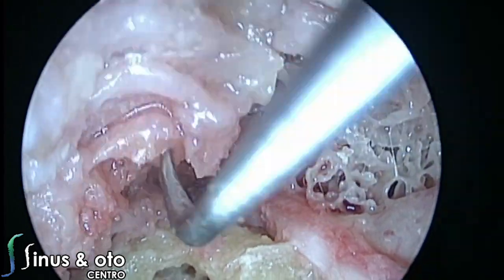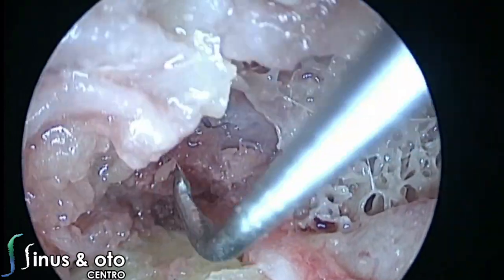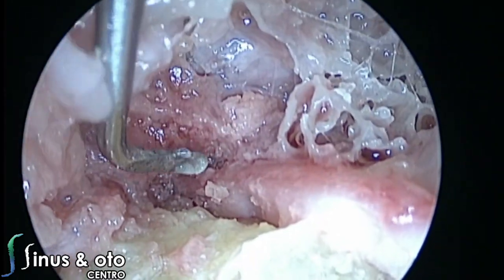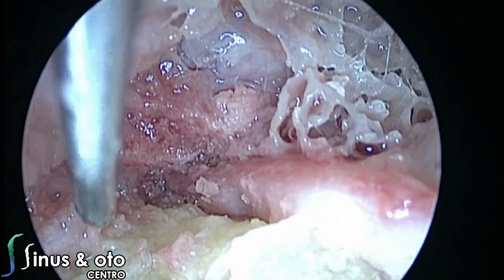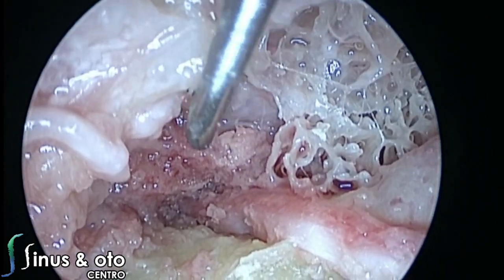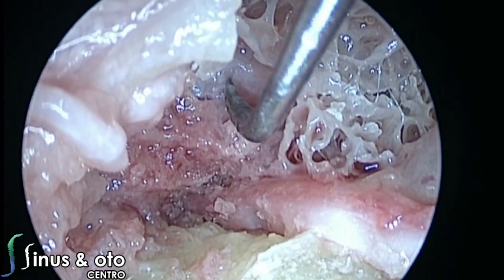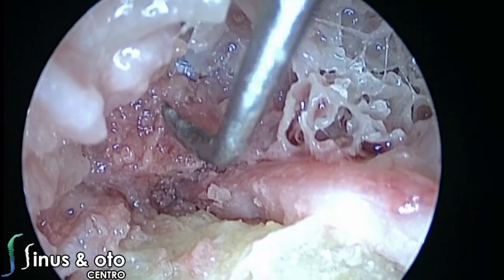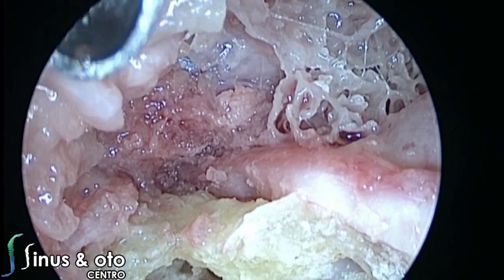So now we are going to show the relationship between the middle fossa dura, the geniculate ganglion, and the greater petrosal superficial nerve. This region here, the supratubal recess, is where the dura comes closer and descends towards the geniculate ganglion and the greater petrosal superficial nerve. The dura is already a little bit exposed here in the supratubal recess, but we're going to expose a little more of it, just for you to see the relationship between the middle fossa dura and the geniculate ganglion.